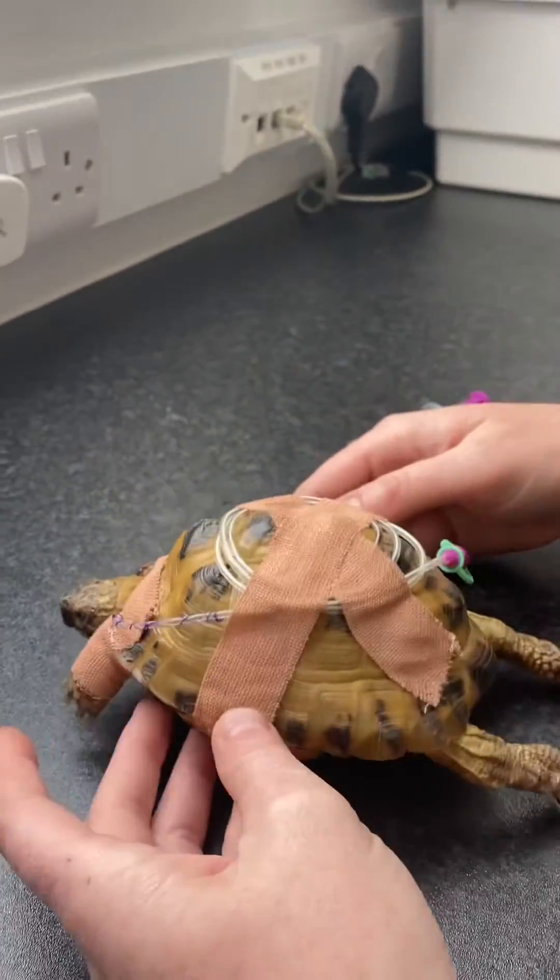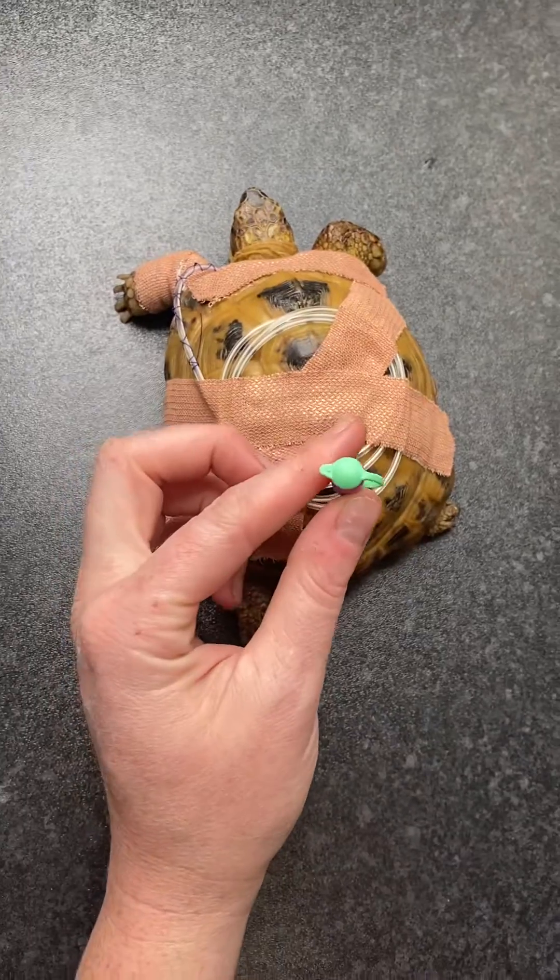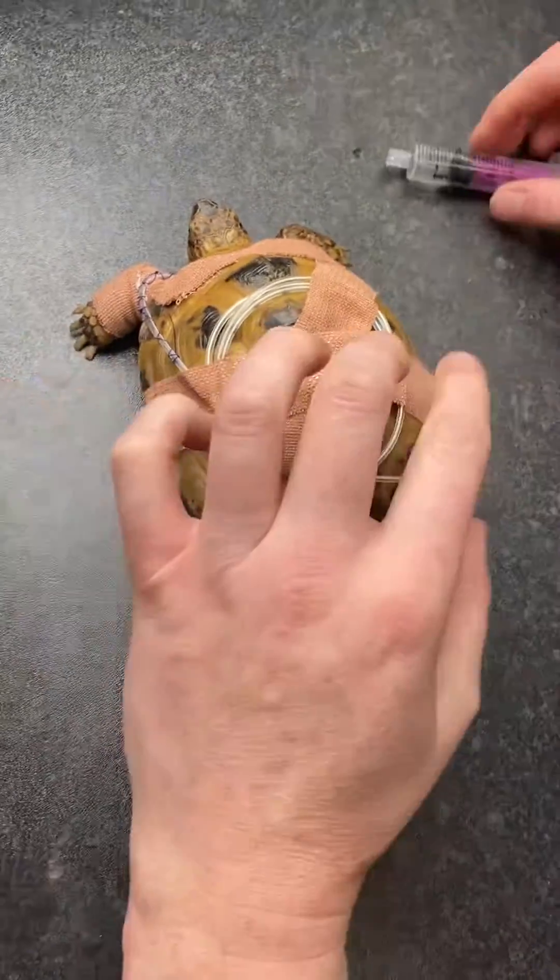Your vet should have taped the tube to the top of the shell, and most tubes will come with a little bung on the end that should always stay covered.